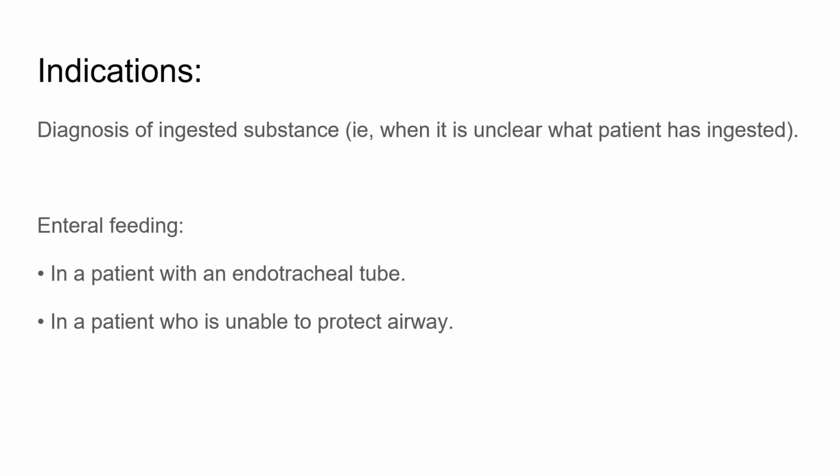So indications also: diagnosis of ingested substance, that is, when it is unclear what the patient has ingested. In such a condition it is inserted. And enteral feeding in a patient with an endotracheal tube, in a patient who is unable to protect the airway.